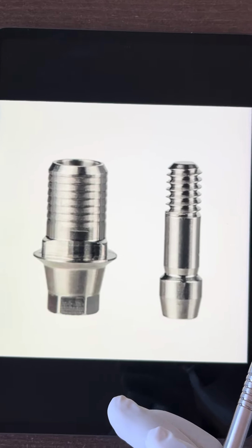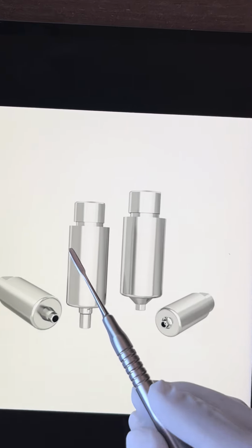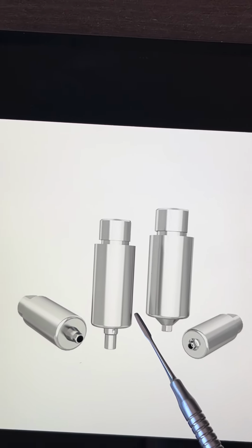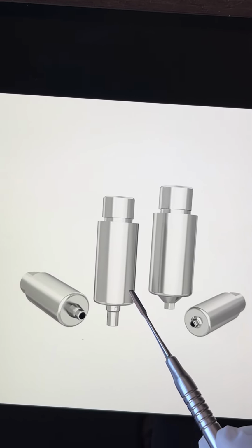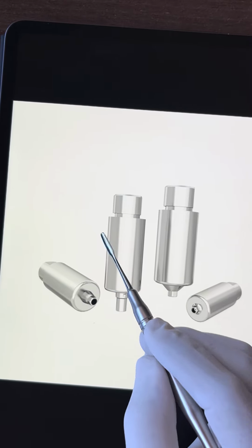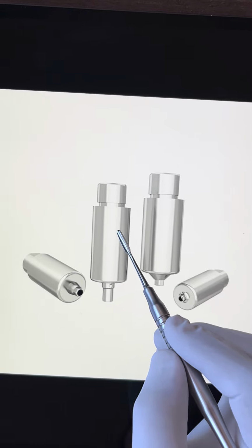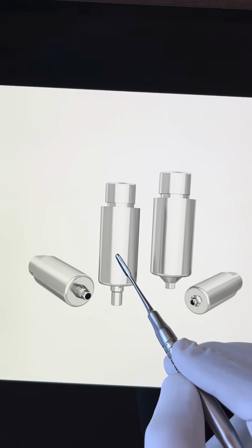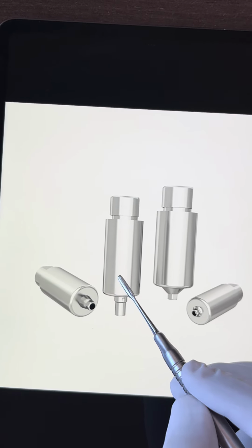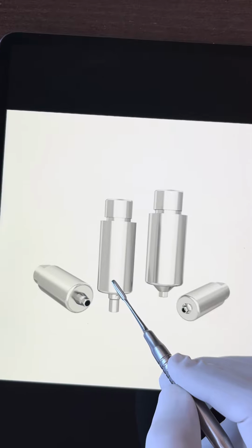Let's talk about another type of abutment, which is called the pre-milled abutment. You see, a pre-milled abutment will have this big metal blank, and as per the patient's requirement, or the patient case, I would say, these abutments will be shaped for the crown or for the prosthesis, right? So it will have a very accurate customization as far as considering the patient's crown.